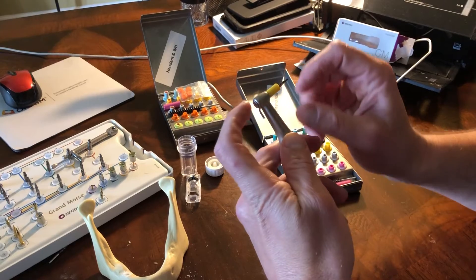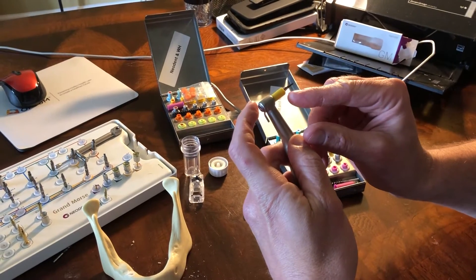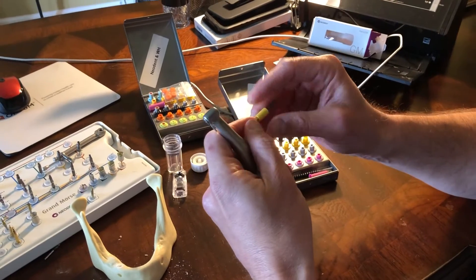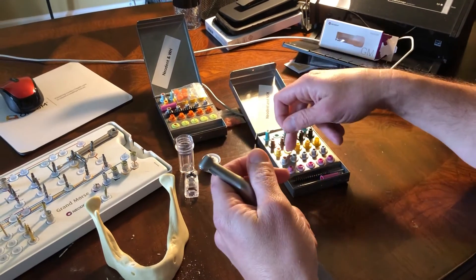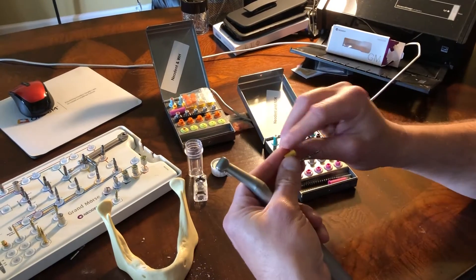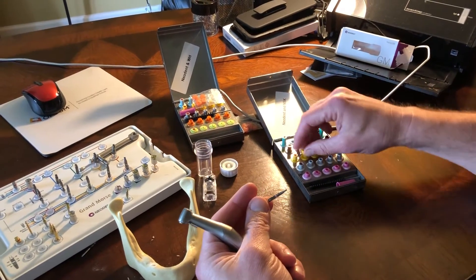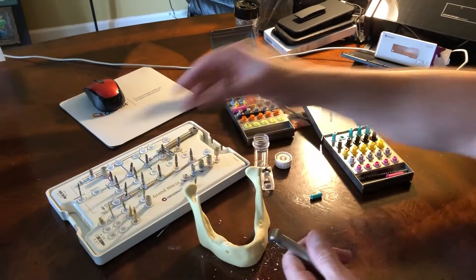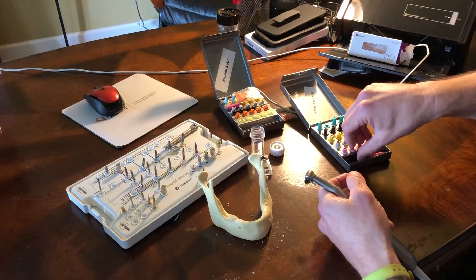The biggest thing about Neodent is: if we're placing an 11.5 implant, we would actually want to use the 13 length drill stop and drill at least a millimeter and a half, or ideally two millimeters, past the length of that implant — as long as there are no anatomic structures in the way. And that's it for this Zasio kit.